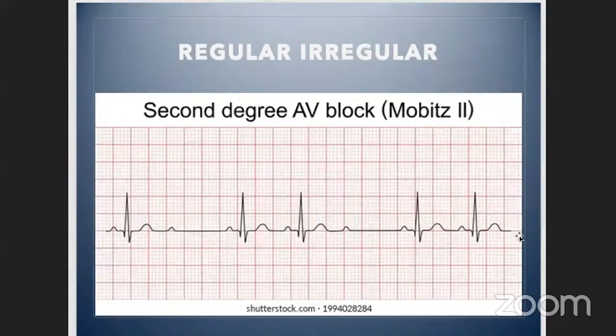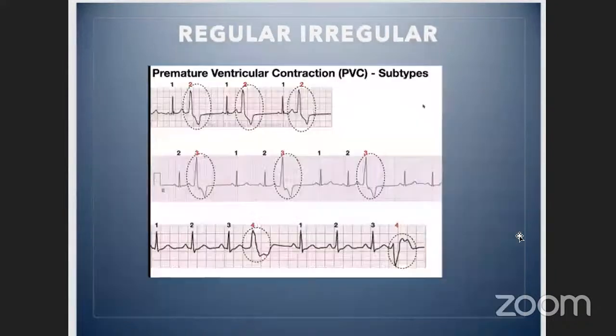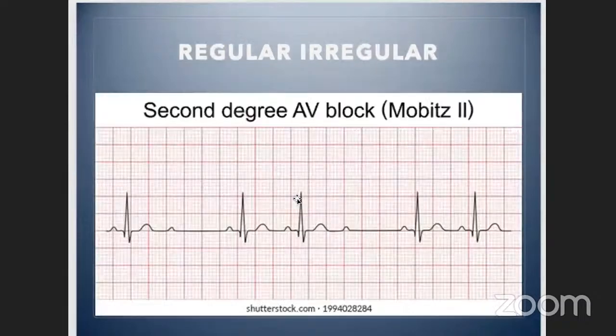And so this would result in a regularly irregular block that clinically wouldn't be any different, if we were to feel the pulse, to our ventricular trigeminy.